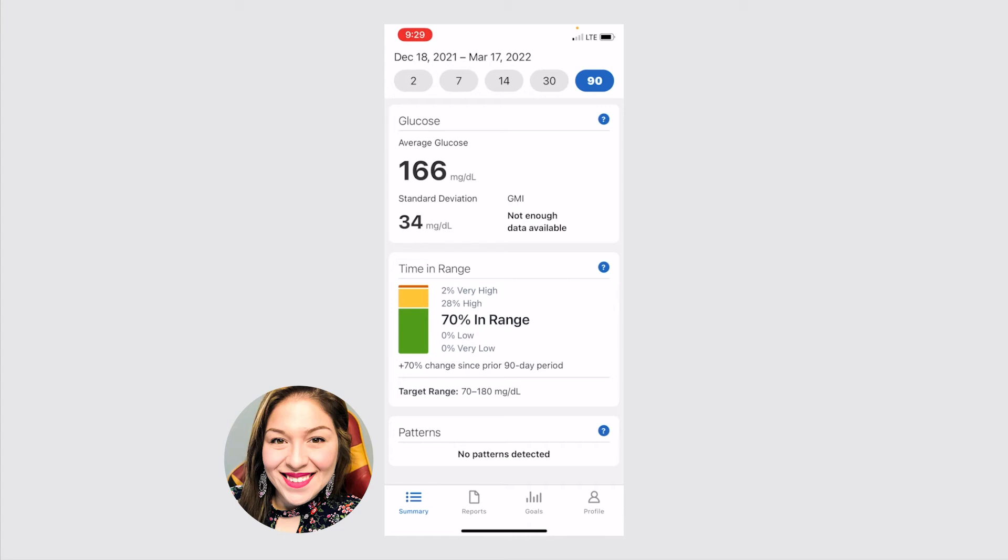It'll show you what your, for the past 90 days, we have 90 selected, what your average glucose levels were, what the standard deviation was, and standard deviation just means plus or minus that number. So for this example, my blood glucose levels were 166 plus 34, so my highest was around 194, or 166 minus 34, so it was around 130 for the lowest.